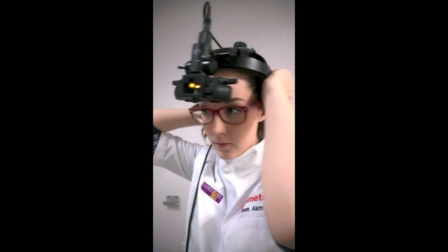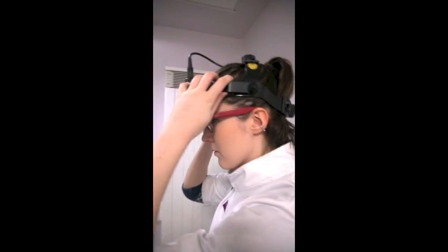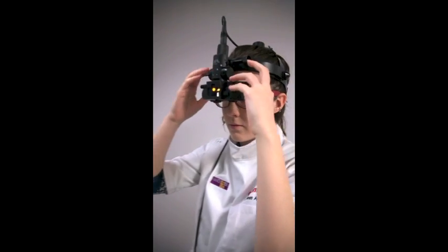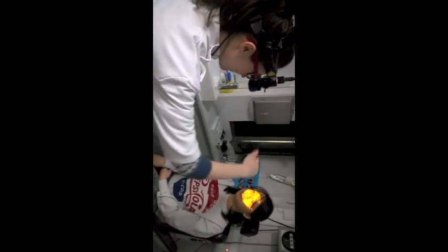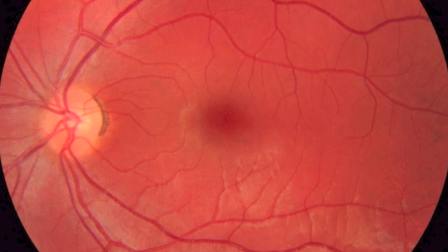Firstly, the patient must be dilated. Again, we must remember to check their anterior chamber angles for risk of closure. Routine headset BIO is done seated, although it is ideal to have the patient lying down. Adjust the height of the patient's chair as appropriate, ensuring that you are at eye level.